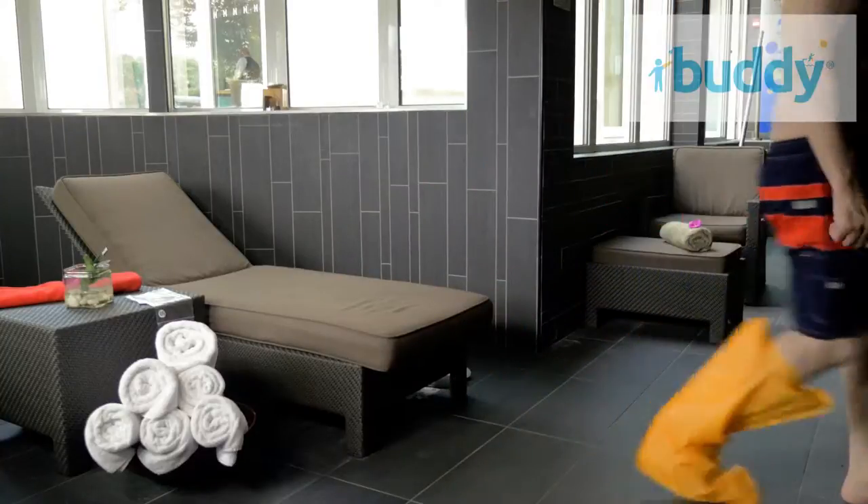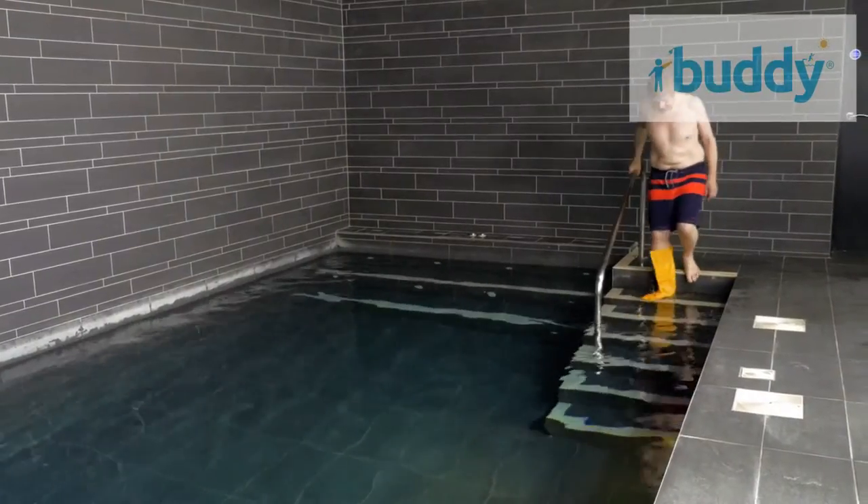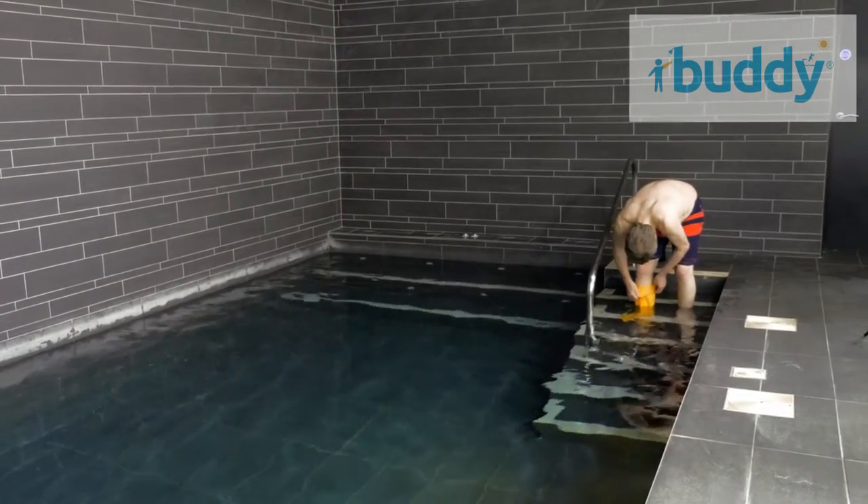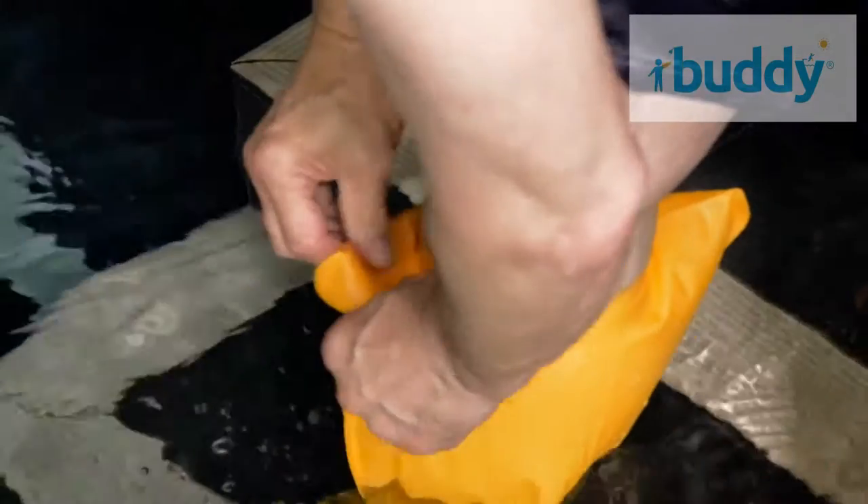Buddy covers are designed to give maximum mobility and use of your limb, even in the pool. Simply place your limb into the water — as you do so, the air will rise.